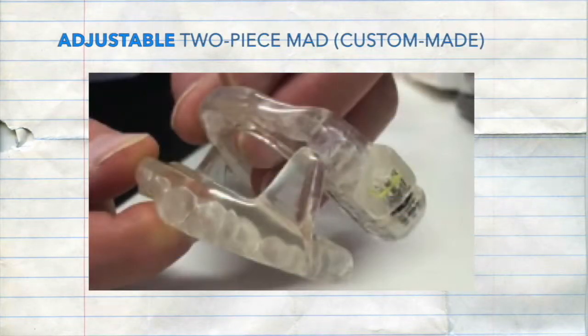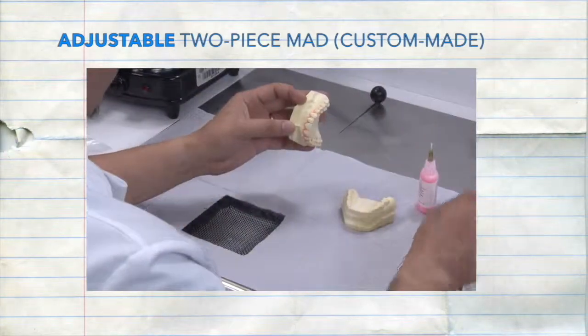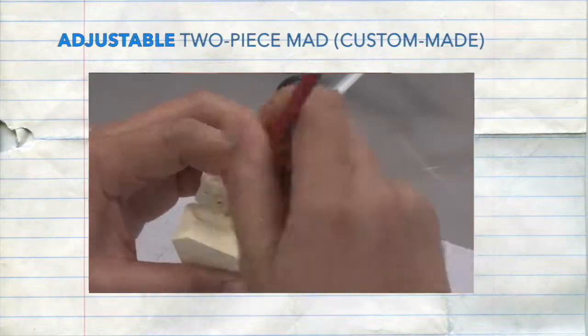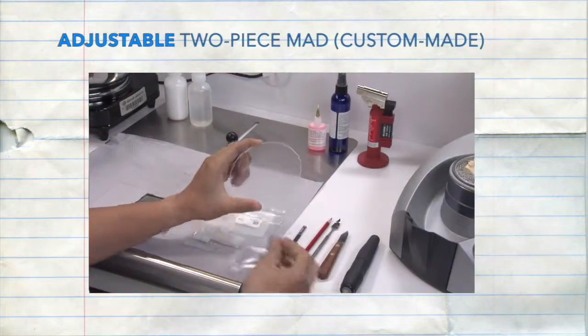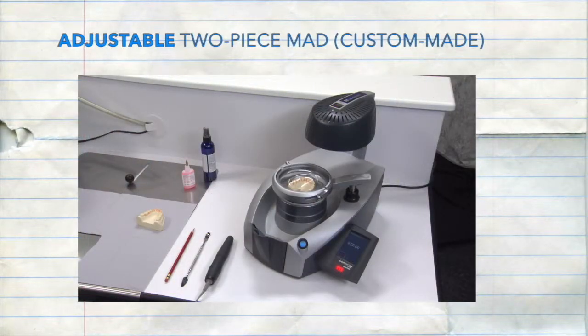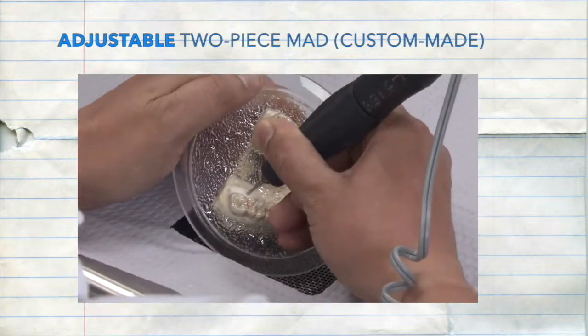The custom-made adjustable two-piece. These MADs are constructed in a lab using dental impressions from dentists. These impressions are then made into casts. But before putting it on the vacuum former, the undercuts of the cast are first blocked off by wax, and you should carve out any distortions that may disrupt the shape of the MAD. Mark the template on the model cast between the upper canine and premolar, then between the lower last molars.